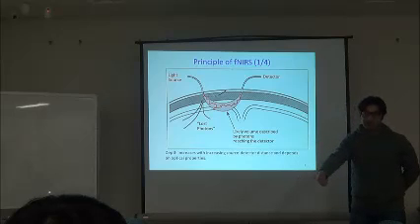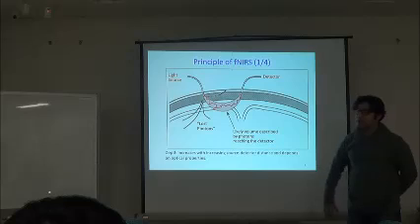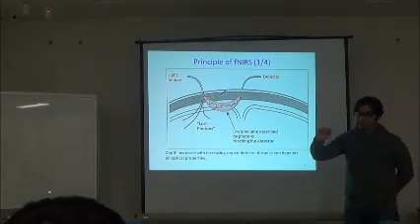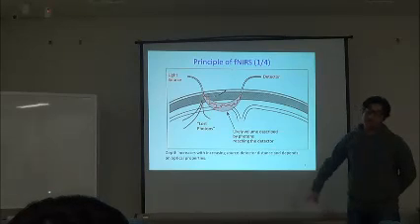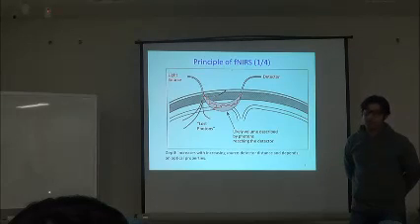Think of these infrared pointers or the remote control. Your parents usually tell you not to look into them, because that's not laser, that's near infrared light. Yes, if the intensity is too high, they can actually damage our tissues. So we usually don't do that.